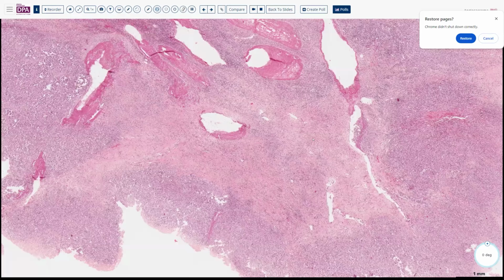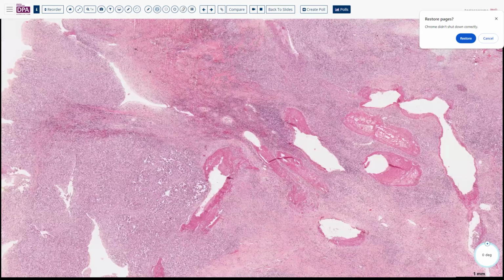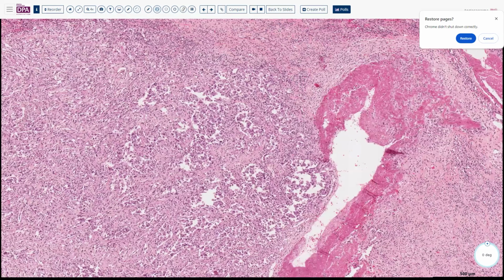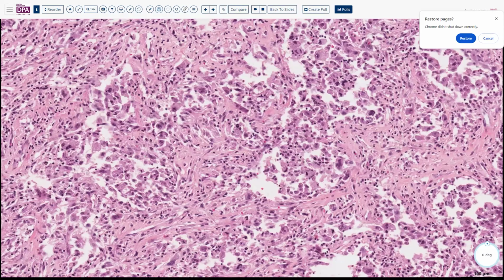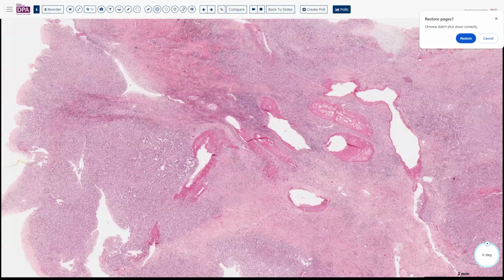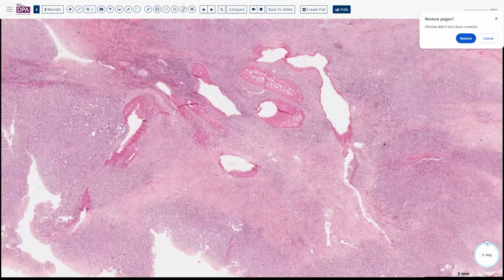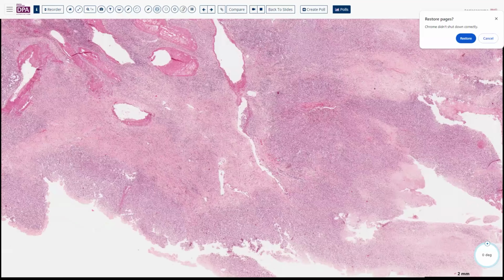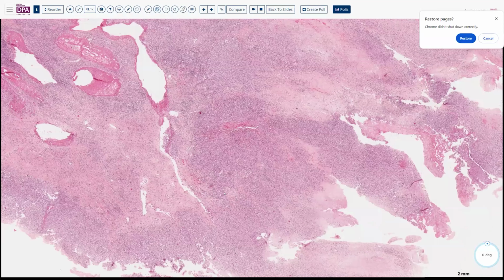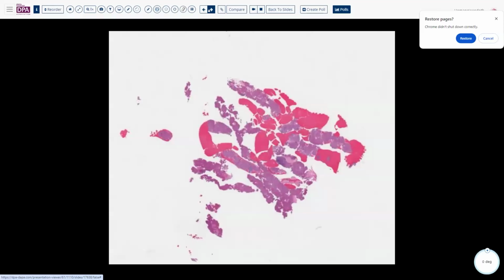involving the right atrium. Malignancies in the heart are not very common, especially not primary malignancies, and typically have fallen into this category of being called angiosarcoma. But intimal sarcomas and other types of sarcomas may be ferreted out of that group of neoplasms as we begin to apply more of the 21st century diagnostic tools that we have to work on these. Okay, let's go on to the next case.